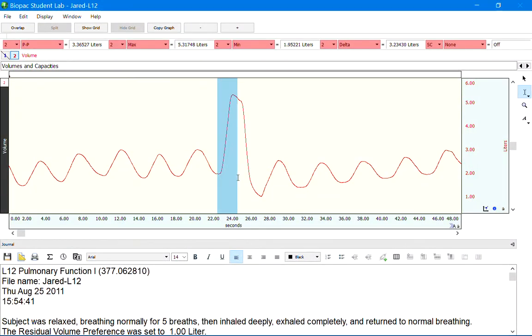And if we go from this location to this location, you'll notice in this case, my 2 delta is negative. Now, in reality, you don't have negative lung values, but it's taking these values and subtracting them, and so the computer program doesn't decipher the differences in total volume. It just says this value minus this value. In this case, it gave us a negative.